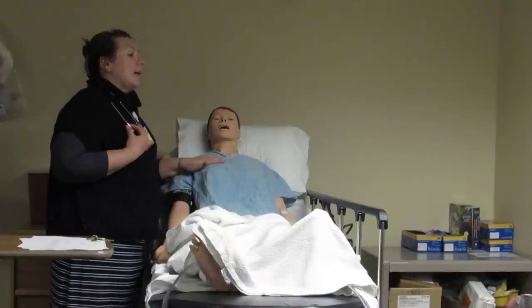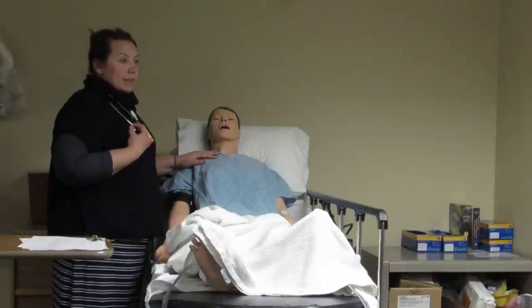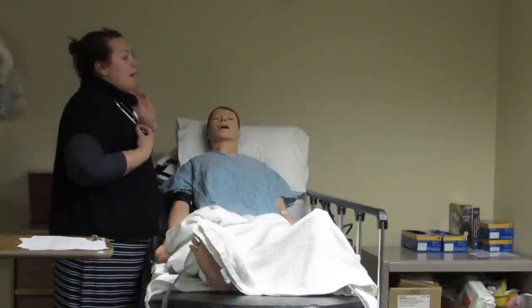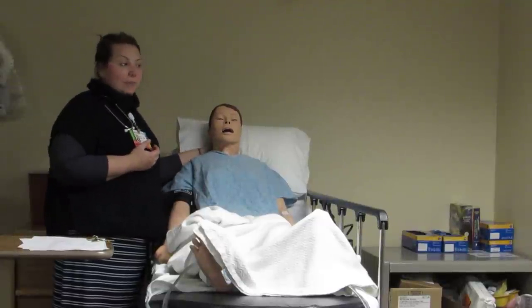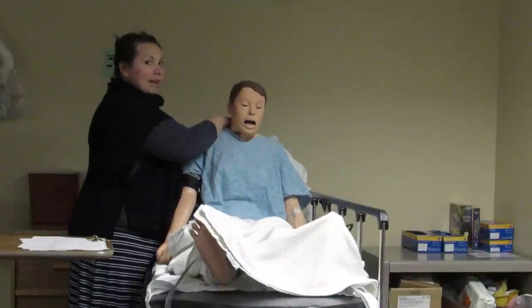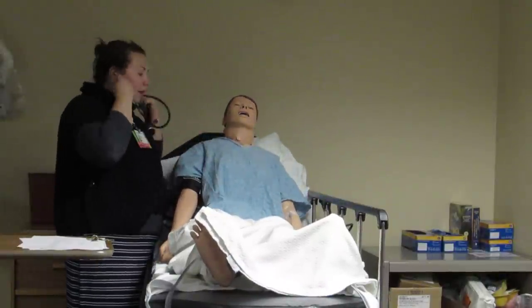My simulation mannequin, you can only listen anteriorly, but for test out, you're going to listen both anterior and posterior. So I'm going to start and ask my mannequin or my patient to sit forward. I would listen posteriorly first. So I would sit my patient up. Hopefully they can hold themselves up. And I'm going to listen to their posterior lung sounds.